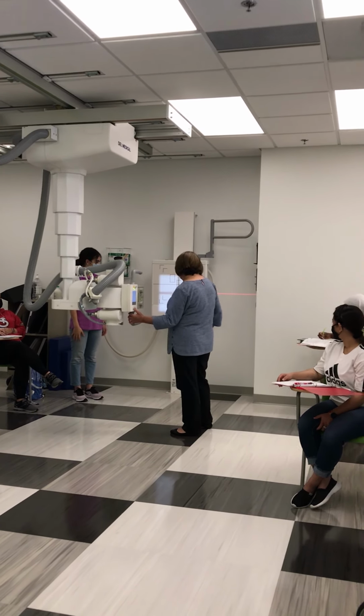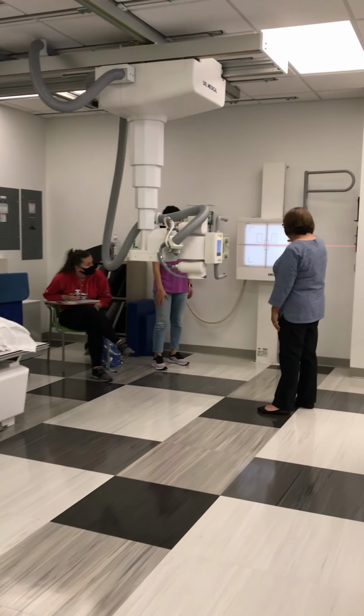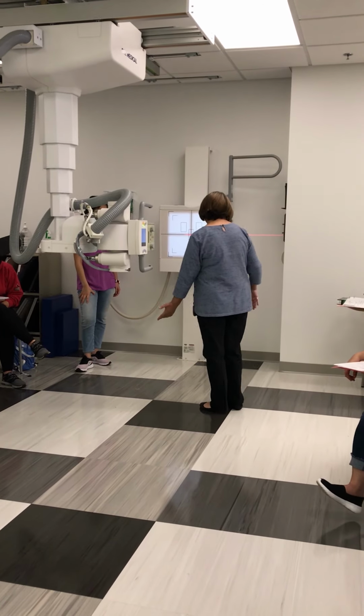When I have my tube in detent, the default is for the collimation size to expand to 17 by 17 inches.